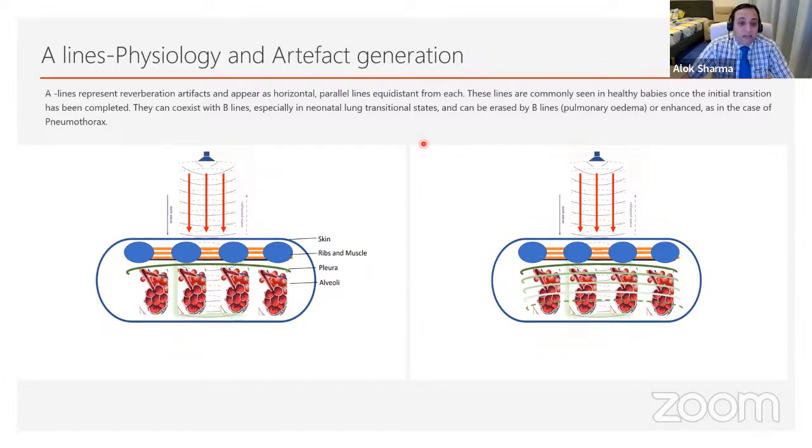On the other hand, you might find that actually there are no B-lines and you can only see A-lines with no pleural sliding, because the parietal and the visceral pleura are actually separated by air. So what you're basically seeing is the parietal pleura and sound waves going in with a lack of attenuation, so that you get horizontal reverberation artifacts again, in the collapsed area of the lung distal to that. So you get this classical A' profile, or A prime profile, as it's described. So what I'd like to allude to is that you really need to make sure that you can describe these in a standardized way.